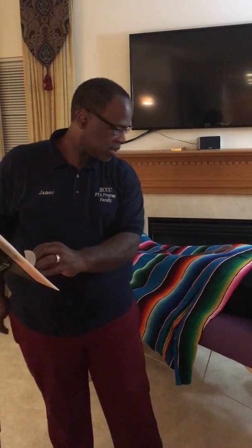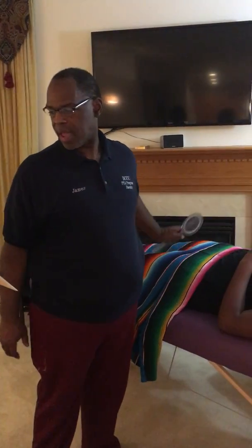Let's look at number 4. A 90-degree angle represents neutral. Reads as 0. Red scale on some goniometers, not necessarily all goniometers. The movable arm alignment in relation to the stationary arm. The shoulder and hip internal rotation, external rotation, hip abduction, adduction, ankle dorsiflexion, and plantar flexion are the examples that are listed there.